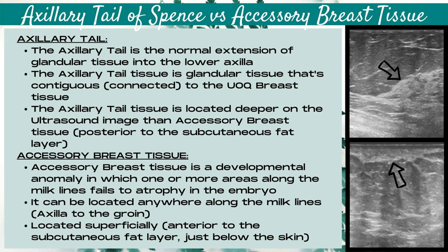Accessory breast tissue is a developmental anomaly in which one or more areas along the milk lines fails to atrophy in the embryo. Accessory breast tissue can be located anywhere along the milk lines, from the axilla all the way down to the groin. This tissue is located superficially on the ultrasound — it's anterior to, or above, the subcutaneous fat layer and just below the skin line.